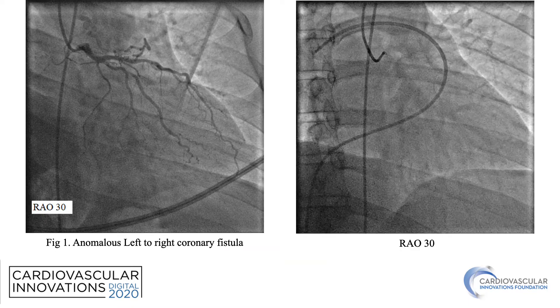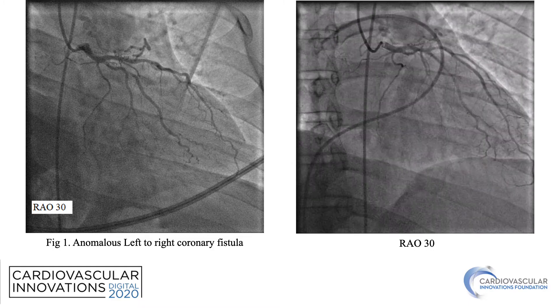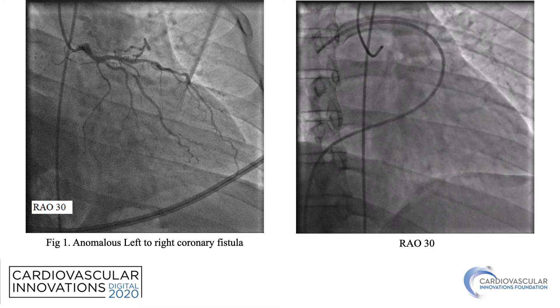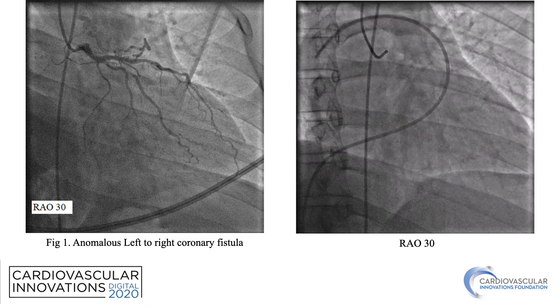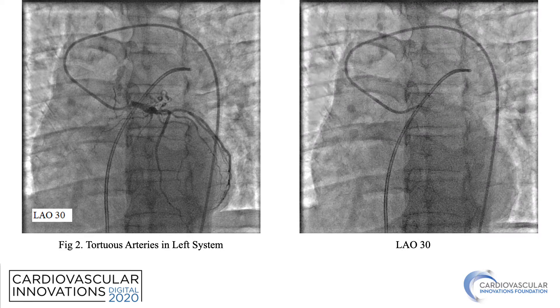This is the coronary angiogram in which you can see that there are some vessels arising from the proximal left system going superiorly and anteriorly. This is another projection showing a network of vessels arising from the proximal left system. You can see the pulmonary catheter positioned in the main pulmonary artery as reference.